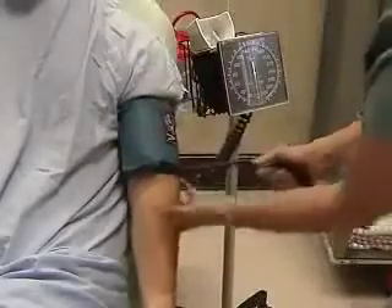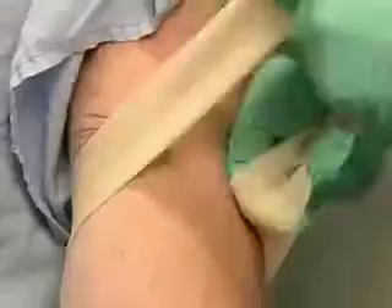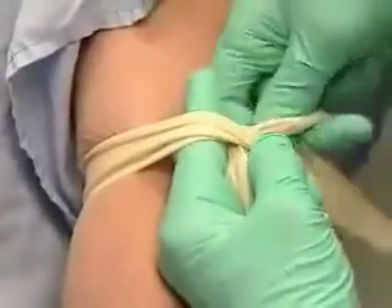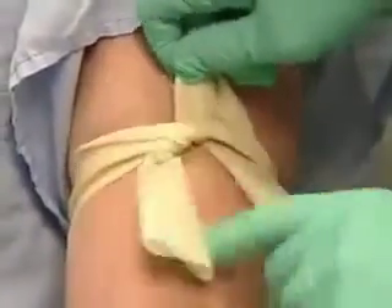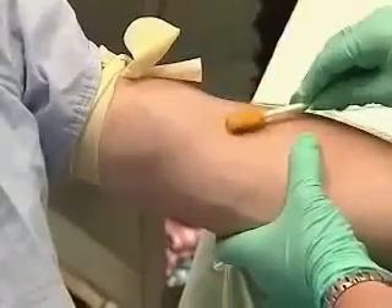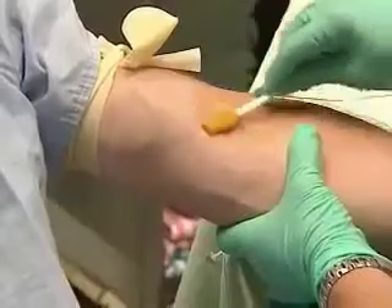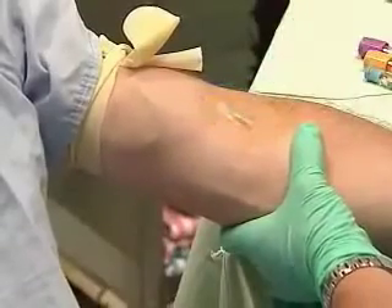To help you raise a good large vein in the antecubital fossa, tying the tourniquet properly takes a little practice. The universal precautions for this procedure begin with gloves and careful cleansing of the skin with alcohol or betadine.